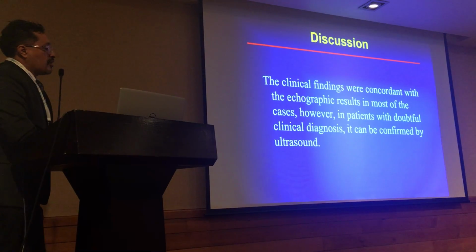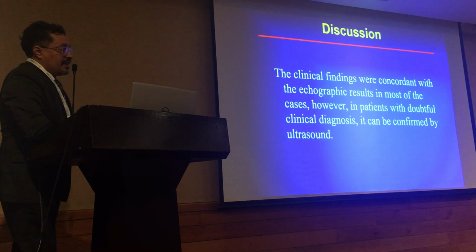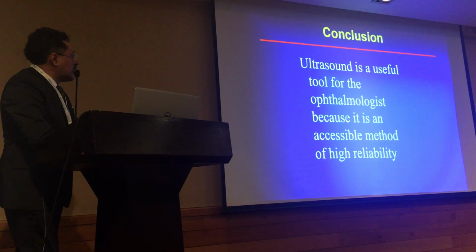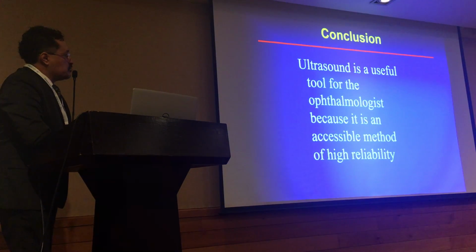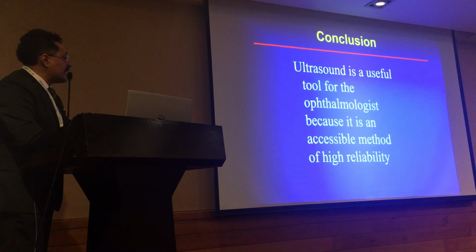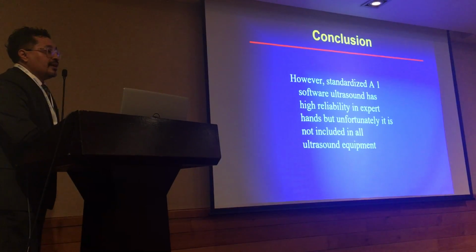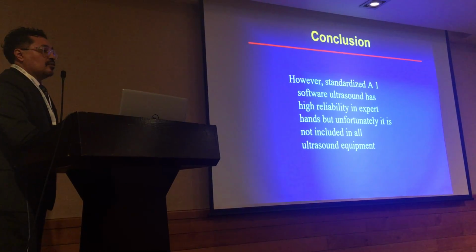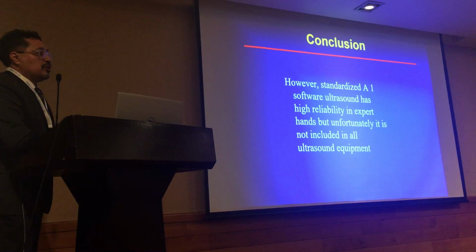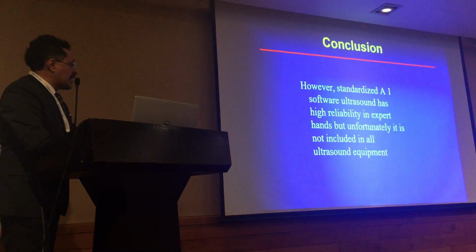The ultrasound findings were concordant with the clinical examination, but sometimes we had a doubtful diagnosis that was confirmed by ultrasound. We concluded that ultrasound is a very useful and accessible tool. We can do the scanning. But the trouble is that not all equipment has the A-scan function, and it's not easy finding other equipment. We only sometimes have the A-scan, but not standardized, and in few cases we have the standardized A-scan.